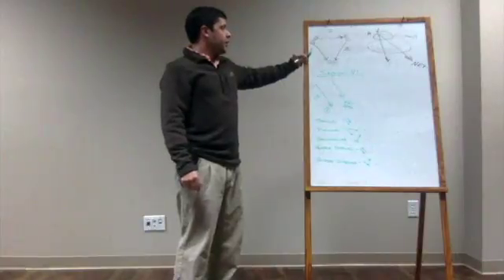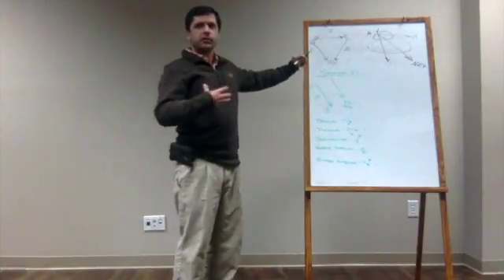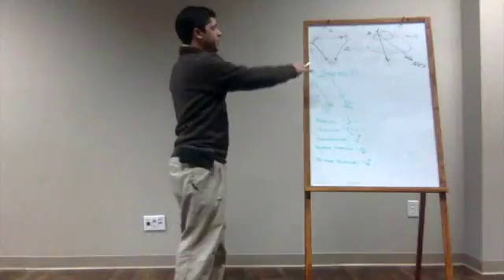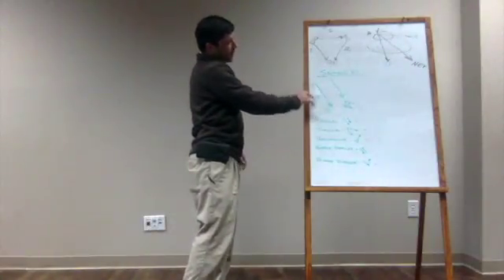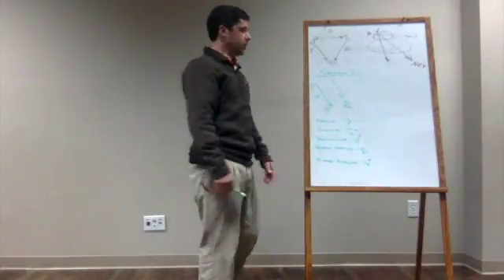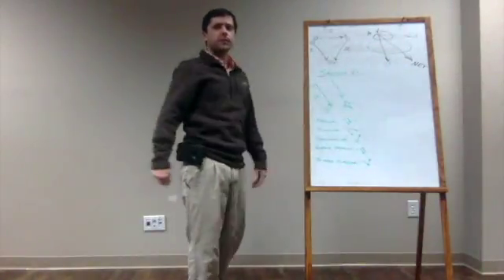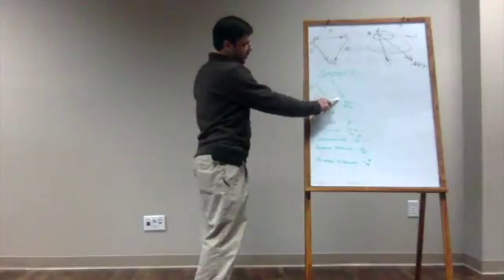So, using Einthoven's triangle that we talked about earlier and that y'all established when y'all hooked each other up to EKGs at the beginning of the class, we'll focus on lead 2. Now, if we isolate lead 2 right here, and we bring it down here, we'll notice that the positive lead takes this angle downward towards here. We'll call it a 4 or 5 o'clock angle on lead 2. Now, we'll move our net depolarization pathway right here, down next to lead 2, and you'll notice they line up pretty well, almost parallel to one another.